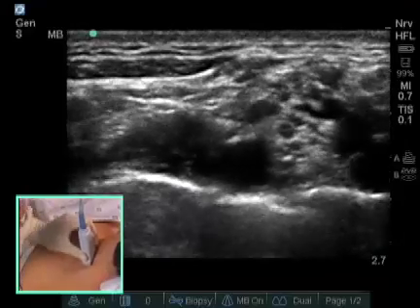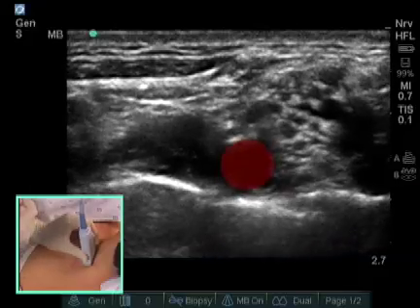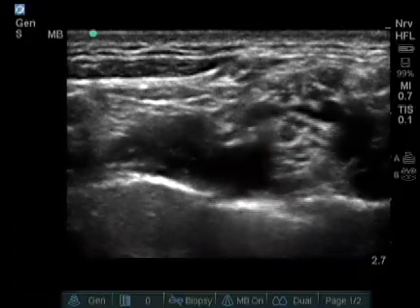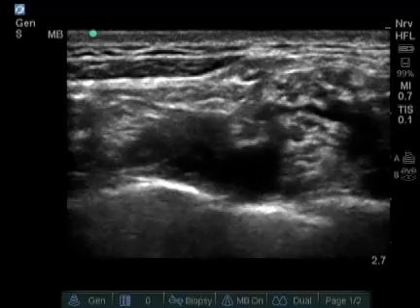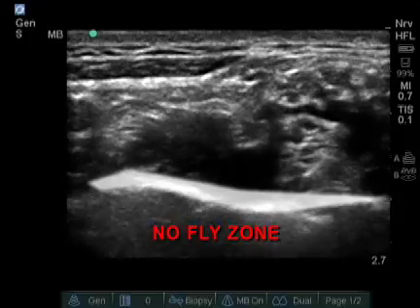We now see a bright white stripe going across the screen with a pulsating subclavian artery sitting on this bright white stripe. This stripe can be either the first rib or it can be pleura. Your needle tip should never be below this stripe — we call the area below this stripe the no-fly zone.